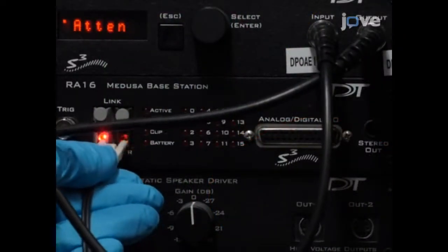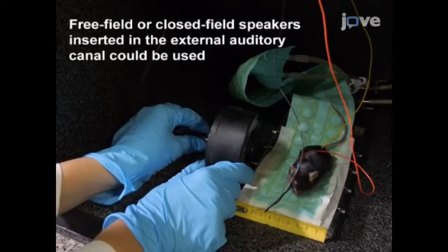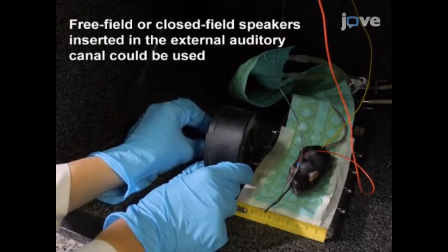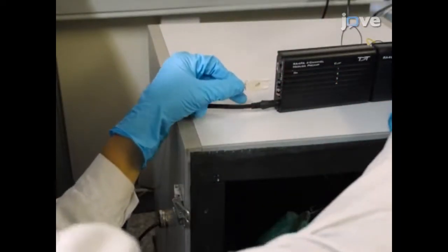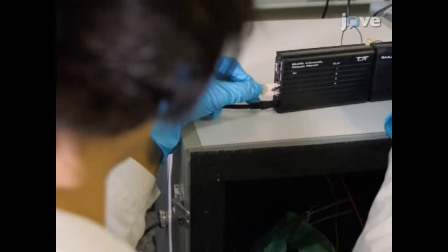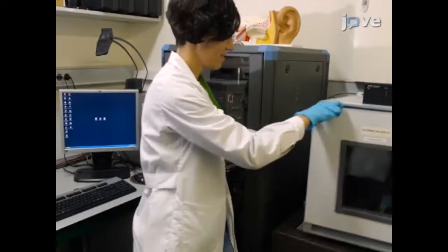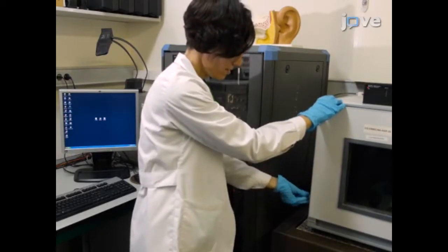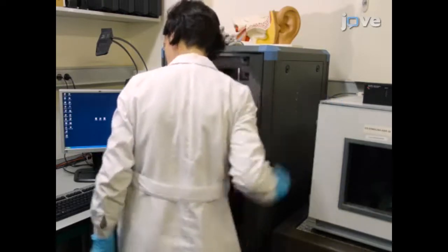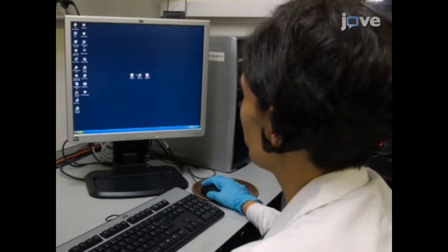Connect the digital to analog workstation output to the selected speaker. Free-field speakers are used here. Connect an amplifier with low noise and a good signal-to-noise ratio to the analog to digital input. Then begin the process to deliver acoustic stimuli into the external auditory canal using preset stimuli or new signals designed with the appropriate software.